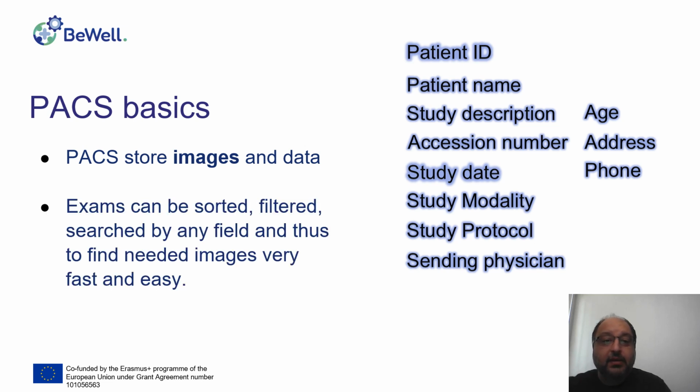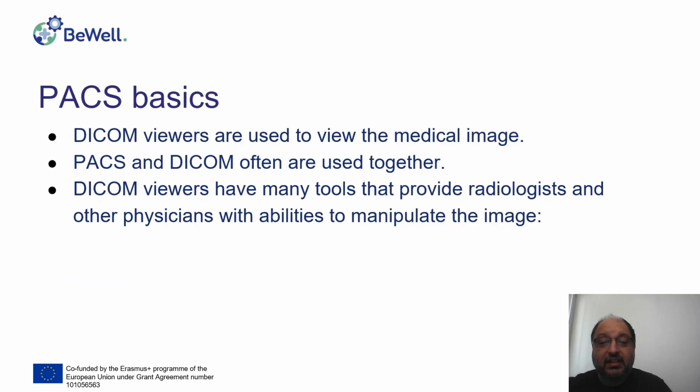Exams can be sorted and filtered and searched by any of the general fields, for example, by the patient's name or by the referring physician and so on. And this allows images to be found very fast and very easily. And the DICOM viewers are used to view the medical image, and PACS and DICOMs are often used together.